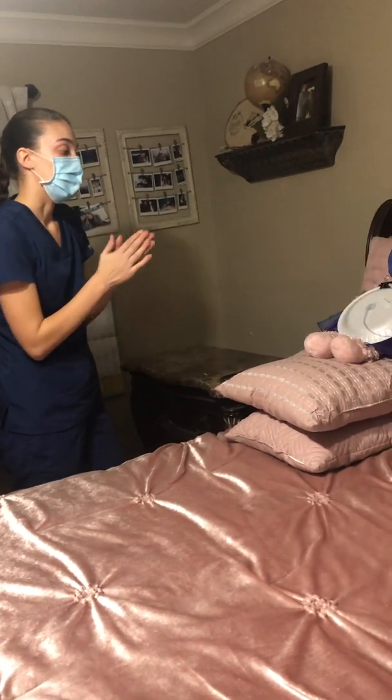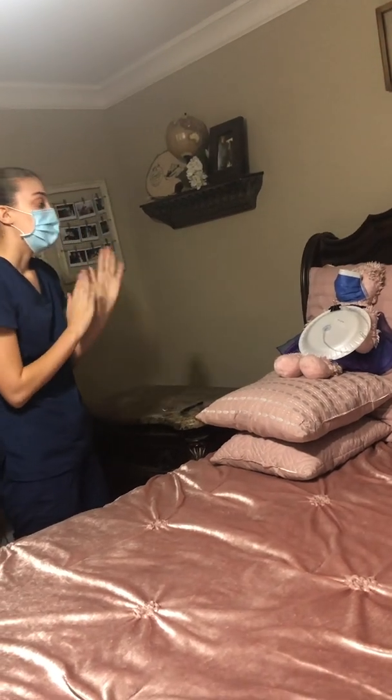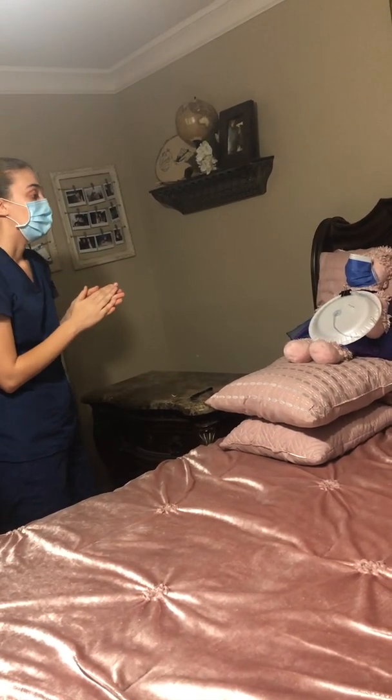Okay, Mrs. Jones, you did very well. It's all done for you, okay? Let me know if you have any questions. I'll come back soon to check on you. And at this time, I will document initials, date, time, the assessment site, as well as patient tolerance to the procedure.